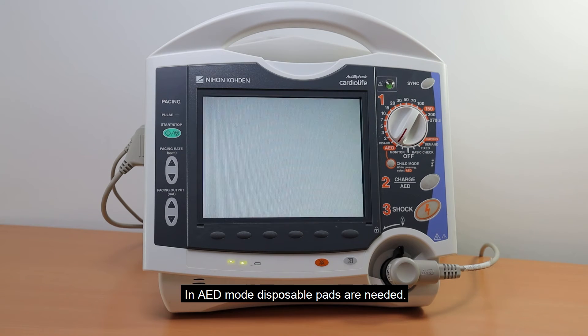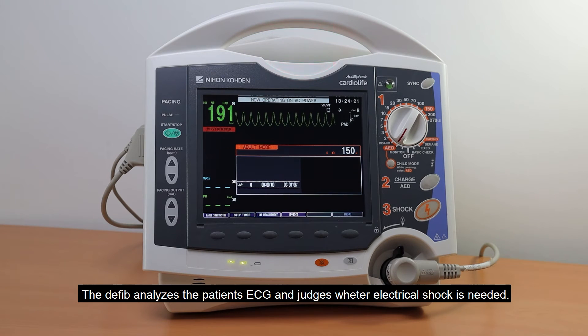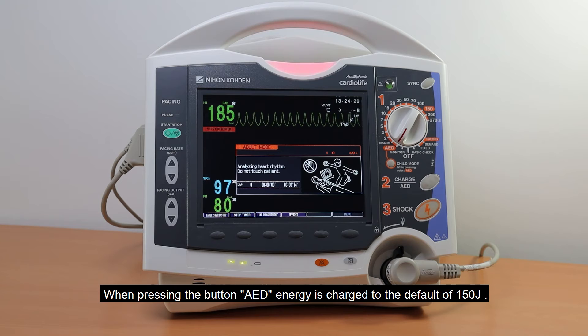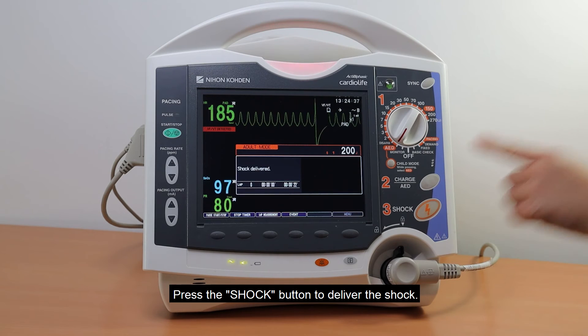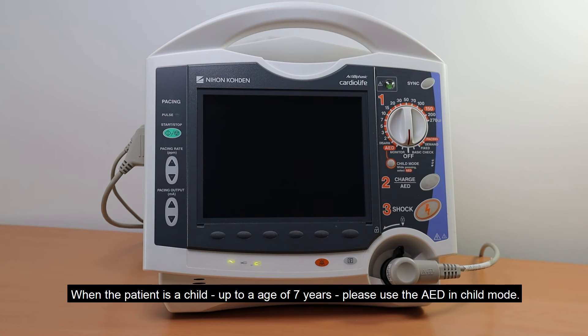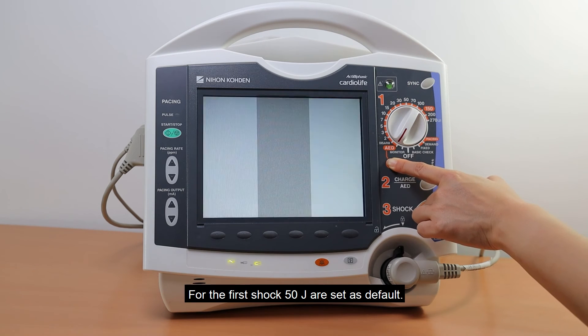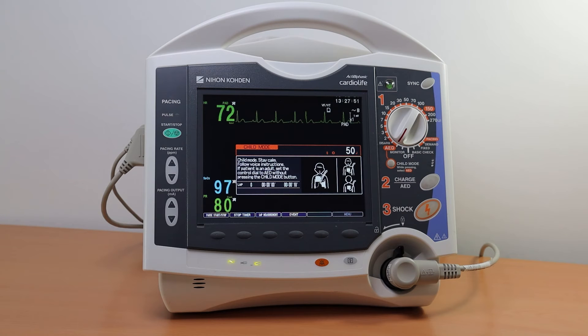In AED mode, disposable pads are needed. The defibrillator analyzes the patient's ECG and judges whether an electrical shock is needed. When pressing the AED button, energy is charged to the default of 150 J. Press the shock button to deliver the shock. When the patient is a child up to age 7, please use the AED in child mode — 50 J are set as default for the first shock. All energy levels can be changed in the system setup. For adult patients, set the control dial to AED without pressing the child mode button.